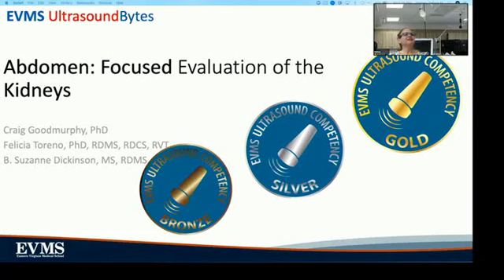I'm here with this episode of EVMS Ultrasoundbytes, and today we're going to talk about a focused evaluation of the kidneys.